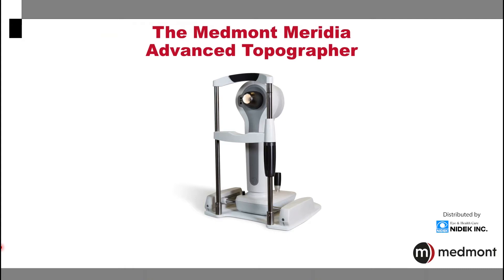Welcome to this introduction to the Medmont Meridia Advanced Topographer. This exciting instrument allows you to perform corneal topography and multiple imaging options that makes for an incredibly powerful instrument in your practice today.